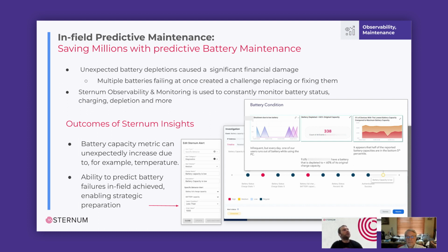So actually you can make a future decision on the future hardware based on this telemetry that you get from this existing equipment. Yep. And we're in the process of building out a new platform that is a lower power platform that is intended to be a substitute or a replacement for the one that we're talking about here. And this data will help them drive the design of that future product and evaluate the power savings in that new design, so we have a basis of knowing how much better it is.